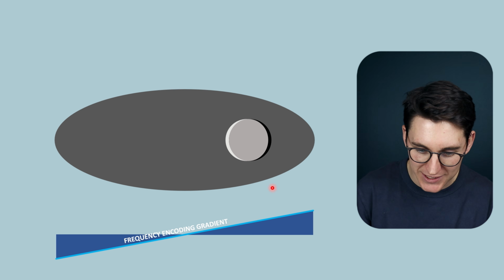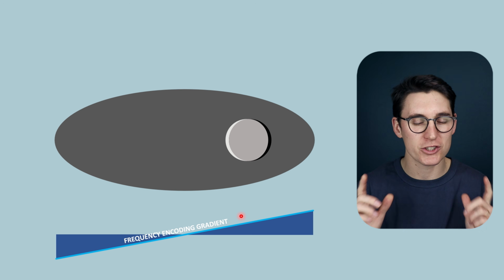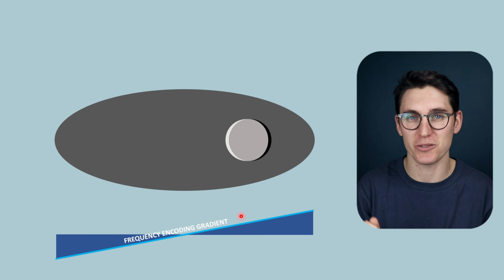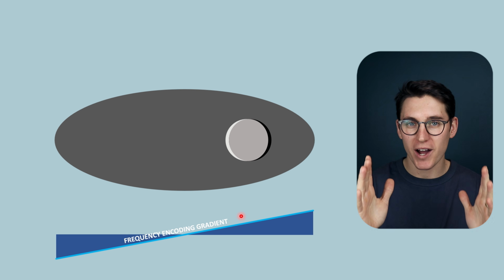Now, what is creating this gradient here? It's our frequency encoding gradient. Now, what determines that frequency encoding gradient? This is why I'm including the chemical shift artifact here. We've been talking about field of view and bandwidth for the last couple of talks. Even aliasing required a bandwidth.